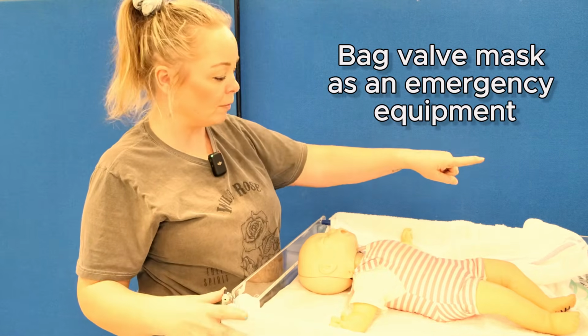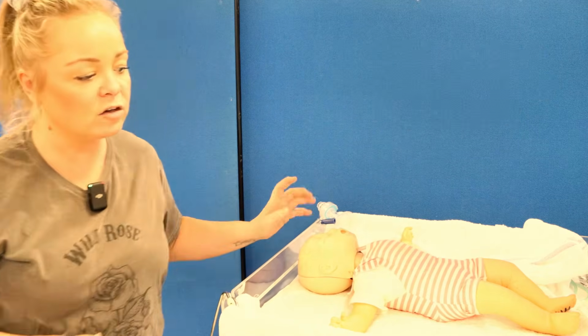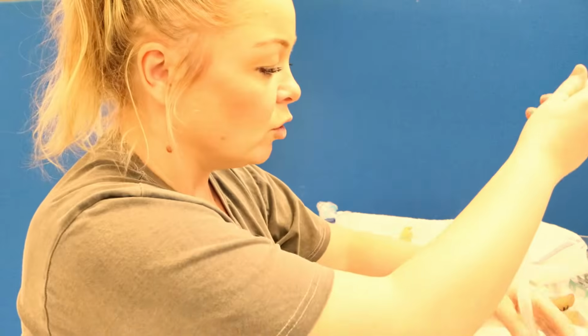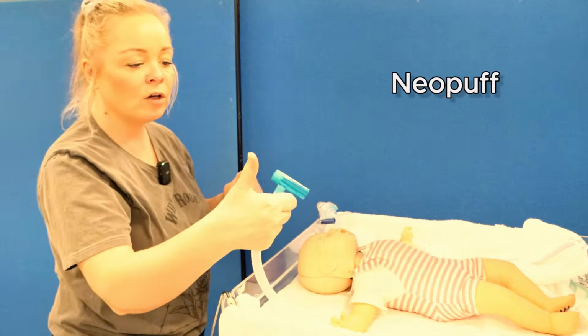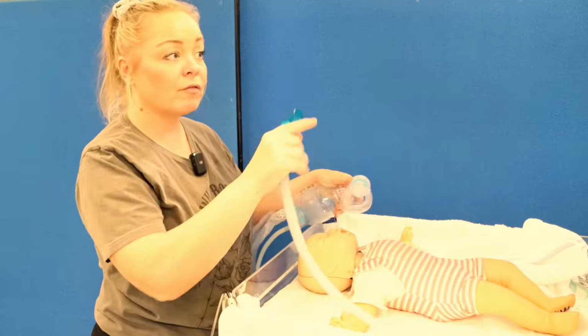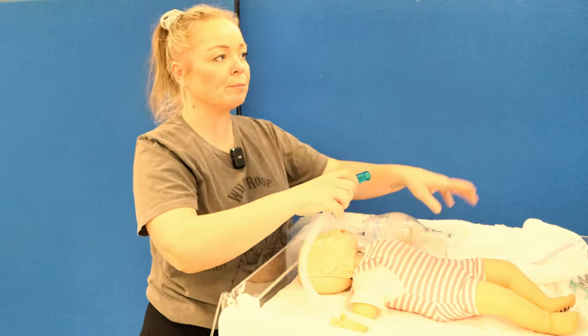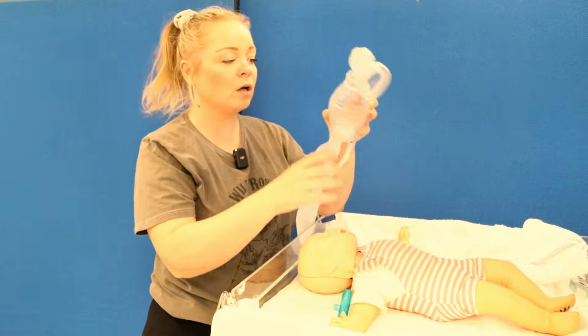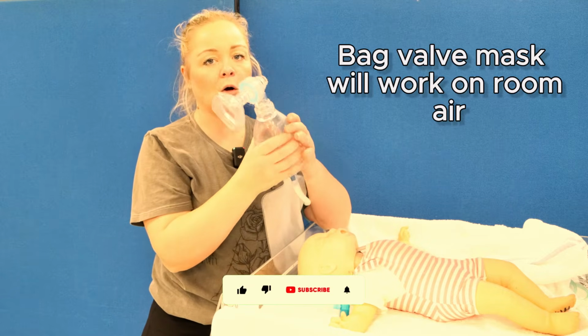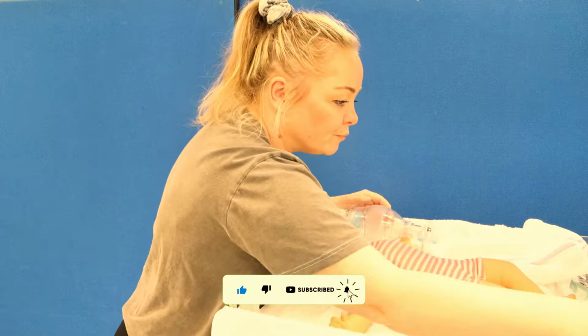You can have your bag valve mask as an emergency equipment at the end of the resuscitator, and you'll also have your T-piece, your Neopuff. We tend not to use these in an emergency as such, just because if the oxygen flow or the machine isn't working, this won't work, whereas the bag valve mask will work on room air just by squeezing. But I'll also show you that after as well.